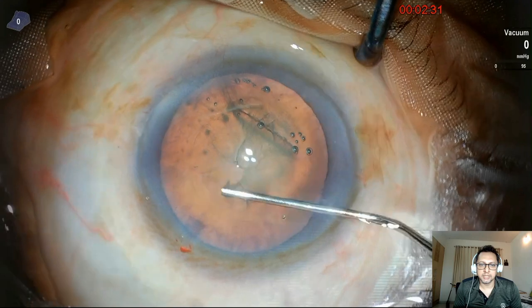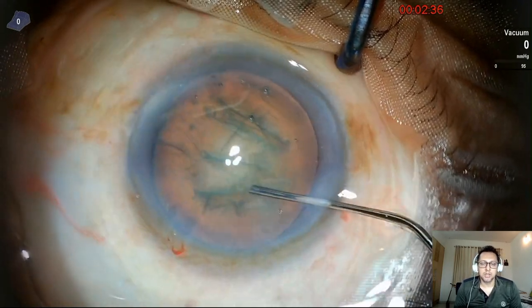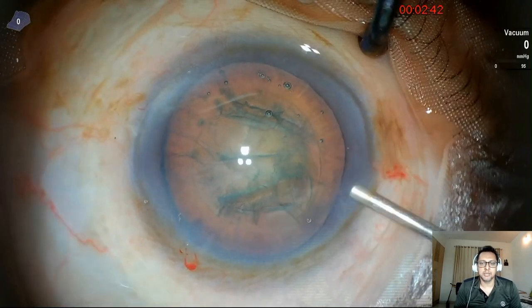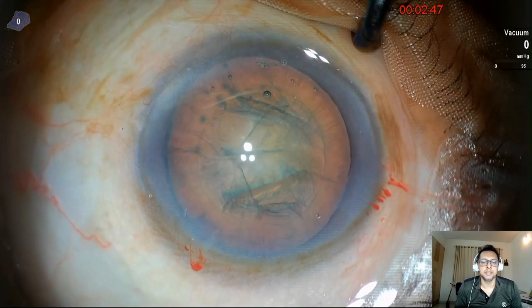And here goes the hydrodissection. Fluid is pushed under the capsule. A good amount of fluid push is important to get this fluid wave. And if you've noticed, I did a little bit of hydrodelineation also.